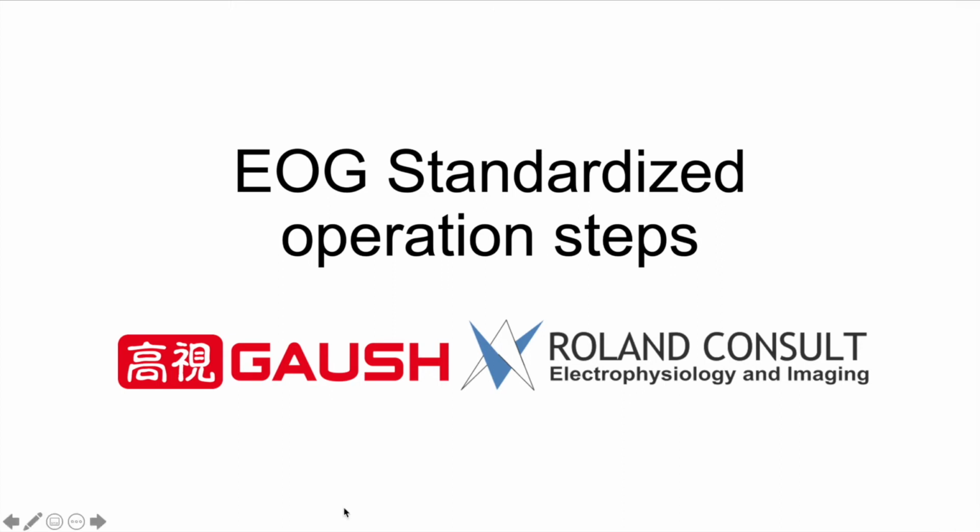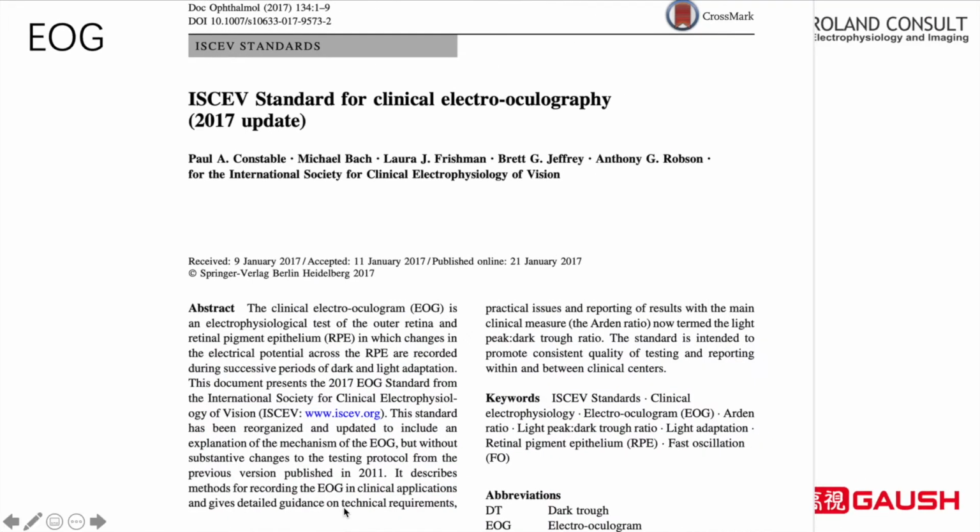Roland Consult EOG standardized operation steps. This operation is performed in accordance with the ISCEV 2017 version EOG standard.